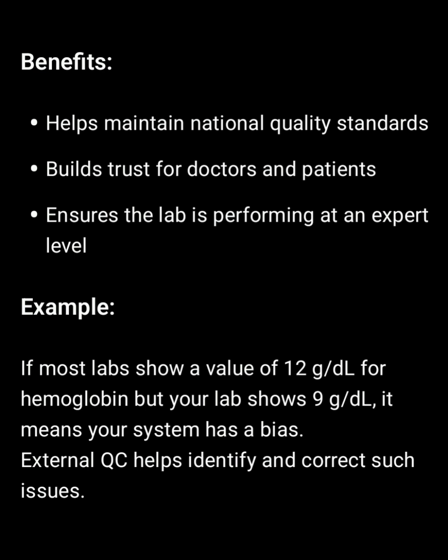Benefits of external QC: helps maintain national quality standards, builds trust for doctors and patients, ensures the lab is performing at an expert level. Example: if most labs show a value of 12 gram per dL for hemoglobin, but your lab shows 9 gram per dL, it means your system has a bias. External QC helps identify and correct such issues.